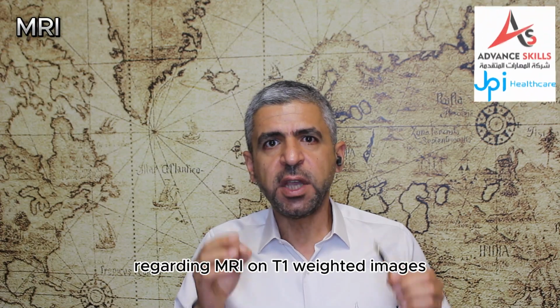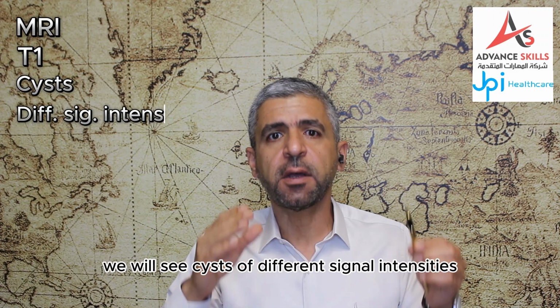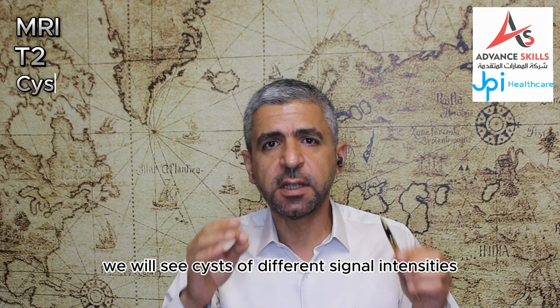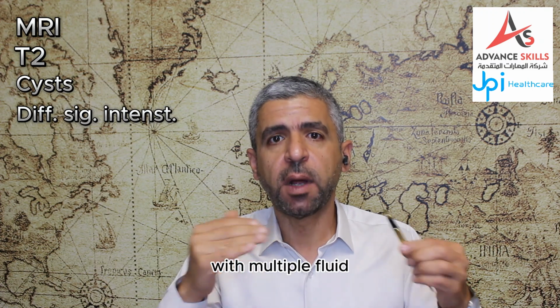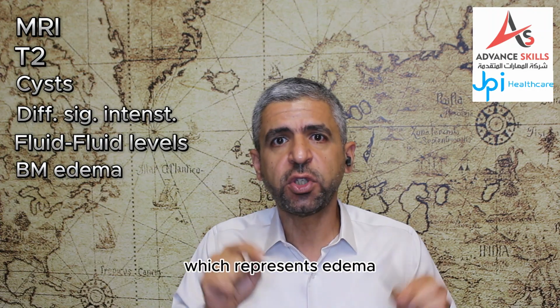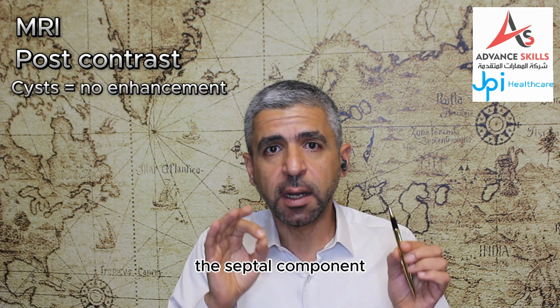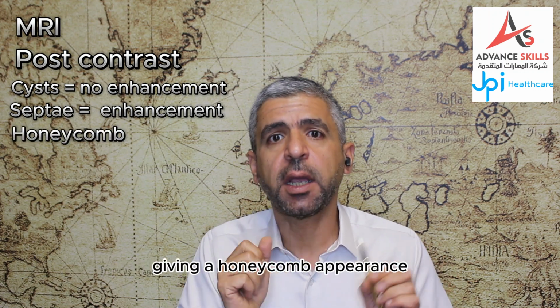Regarding MRI, on T1 weighted images, we will see cysts of different signal intensities representing different stages of blood products, and on T2 weighted images, we will see cysts of different signal intensities representing different stages of blood products with multiple fluid levels, with surrounding high signal intensity, which represents edema. After contrast injection, we will see no contrast enhancement of the cystic component. The septal component can show some post-contrast enhancement, giving a honeycomb appearance.